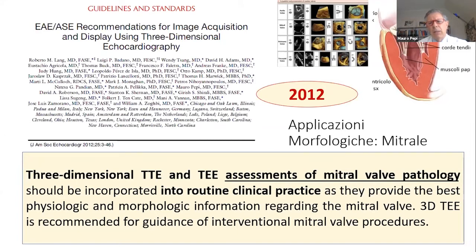But in 2012, and also Franco was involved in these guidelines, we also say that we had a very important assessment of the mitral valve pathology, and we may include this into routine clinical practice by both 3D TT and TE.